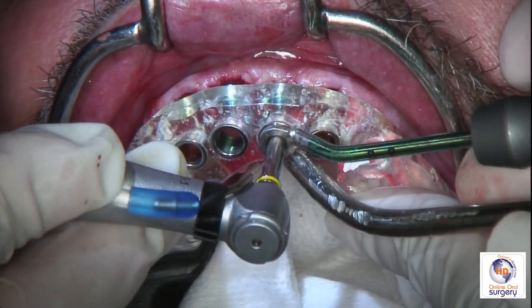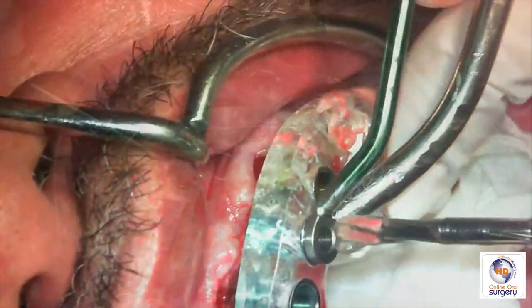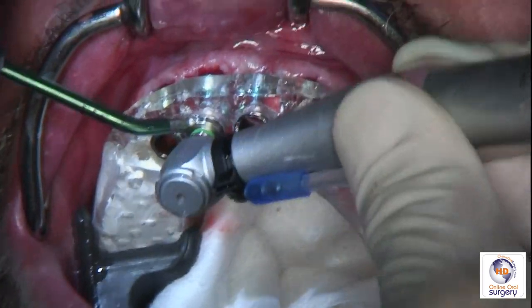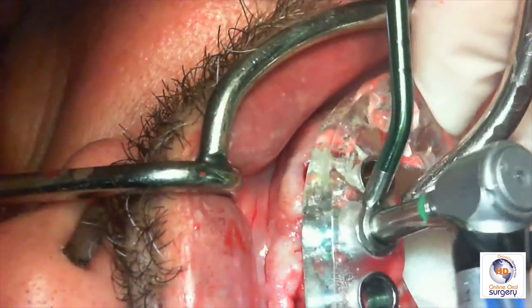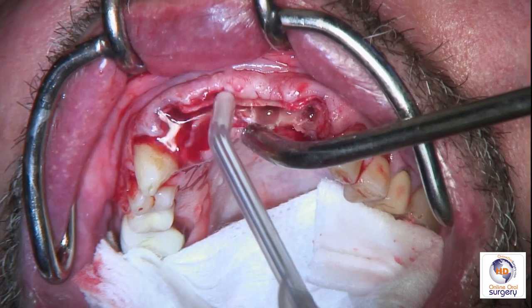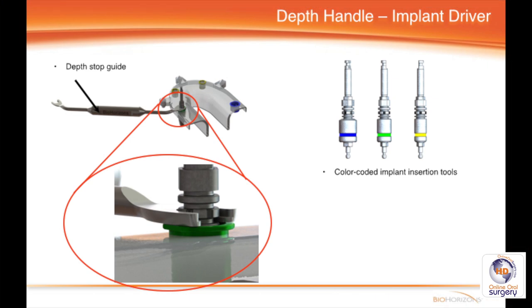We can do that because we're in the maxilla, it's relatively porous bone, and because we've actually split the ridge, which decreases the density in the medullary portion. So after our second osteotomy, we're going to skip to our final osteotomy for our 4.5 millimeter implant, which is a 4.1. Again, we're going to skip the intervening 3.7 millimeter diameter osteotomy drill in this instance. Again, light pressure, short strokes, lots of irrigation, and now our sites are prepared. We're going to remove our surgical guide and thoroughly irrigate the site, make sure that there's no bone debris left, and then we can go ahead and place our implant fixtures.